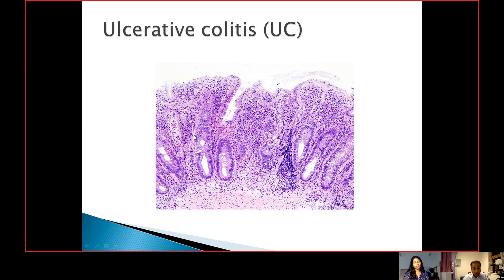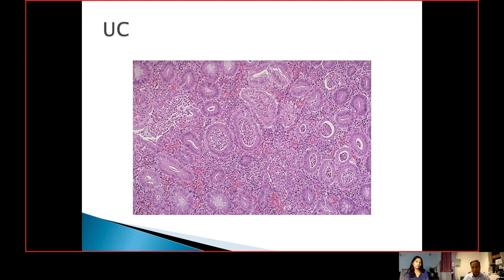There will be some acute changes including cryptitis, patchy or diffuse neutrophilic infiltrate, and crypt abscesses. At this low power magnification you can see this crypt being filled with neutrophils. On higher magnification, what you can see is more striking crypt abscesses all over the place. There would be cryptitis and also significant crypt architecture distortion.